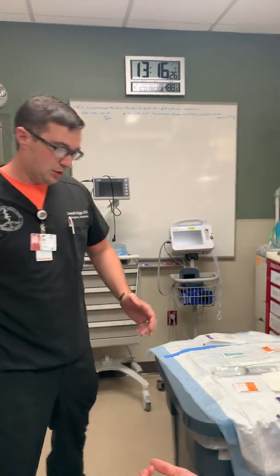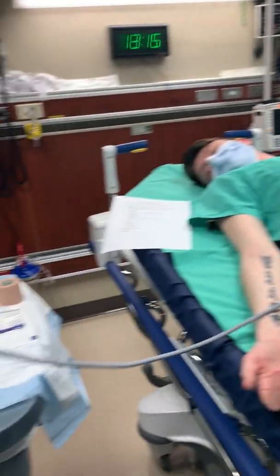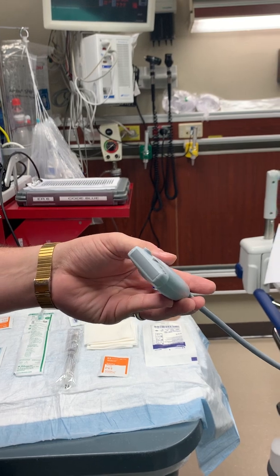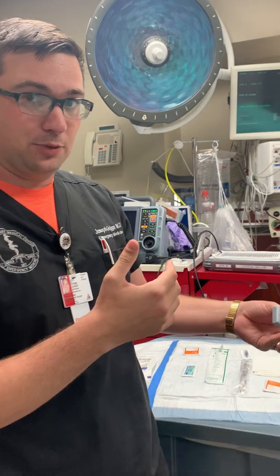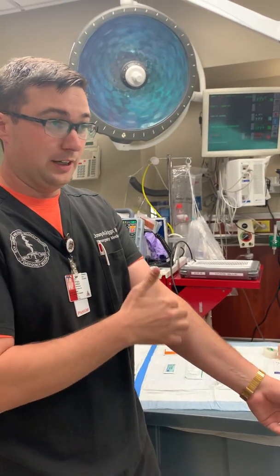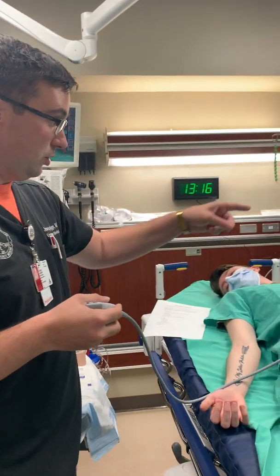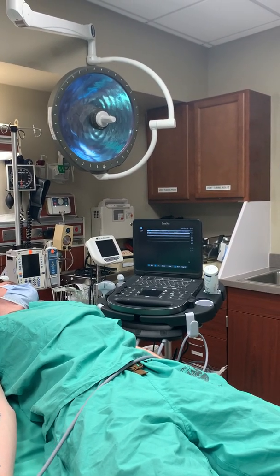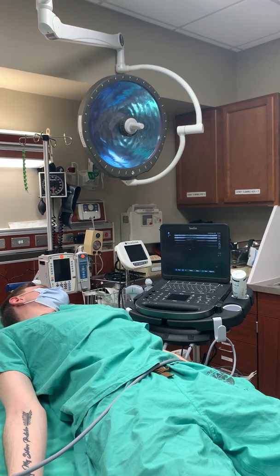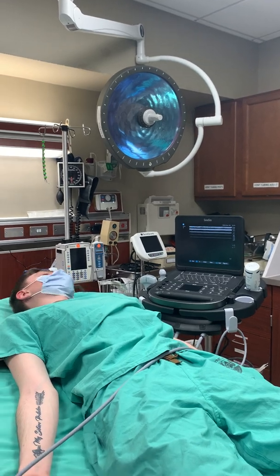I want to go over the equipment. Number one, I've got an ultrasound with the linear probe. There are usually multiple probes with these ultrasounds — normally big thick probes — but there's one that's going to be skinny. It's the highest frequency and it's called the linear probe. That's what you want to use. It's very good for superficial structures in soft tissue. I've got my ultrasound turned on. See all the lines on the top of that ultrasound screen? That's what it looks like when the linear probe is on, and if I press on it you can see it's registering my finger rolling across that probe.